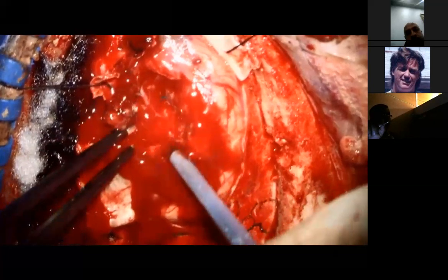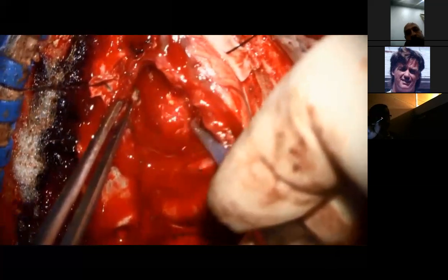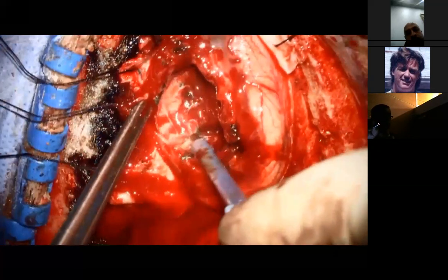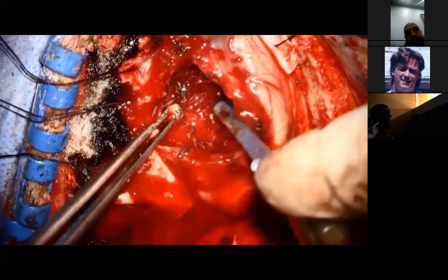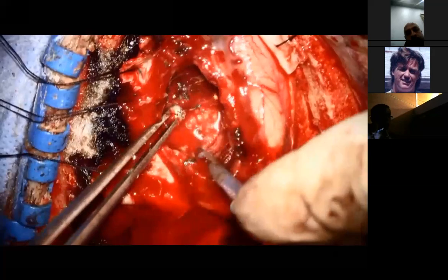But what the embolization helped me with is that some of the tumor became necrotic. So those black vessels on the bottom. Yes, you will see it now as we go through. So again, the whole principle is to debulk the tumor from inside. You can see the embolic material there, the black one. So it made the tumor softer, not much, but softer than what it should be.